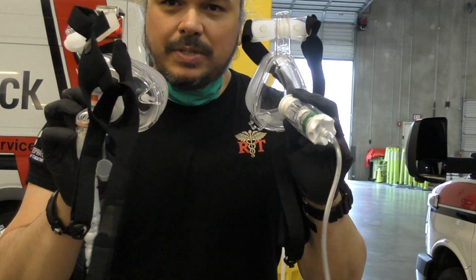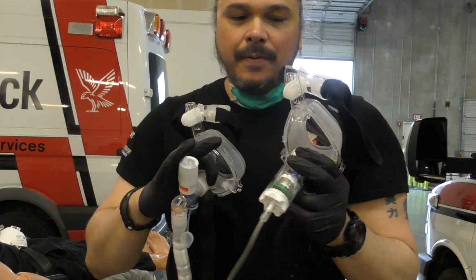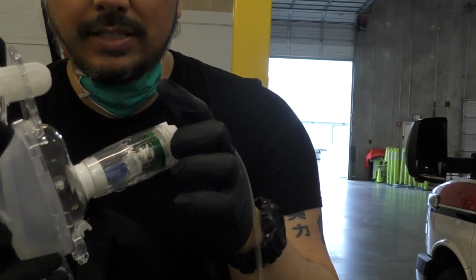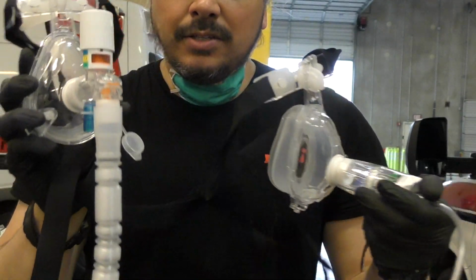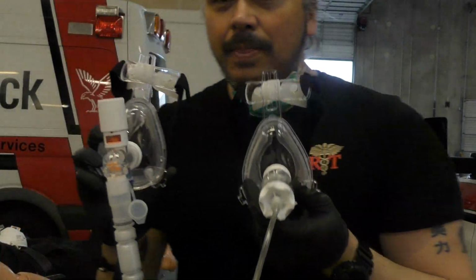Okay, the thing is, you got to protect yourself because these don't have a filter on them, okay? So if you have a patient who's COVID-positive, you don't want them blasting that stuff out. You notice there's little holes here, and that's where the exhalation is. Same thing with this, it's an exhalation right there, and you don't want that blown in your face, right? So we have to create a barrier to help protect us.